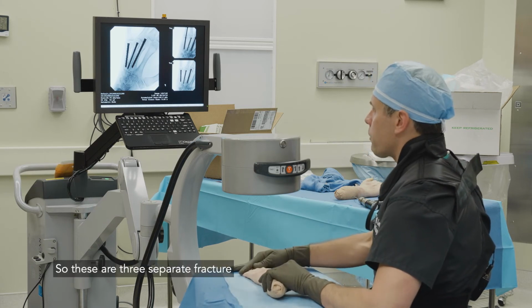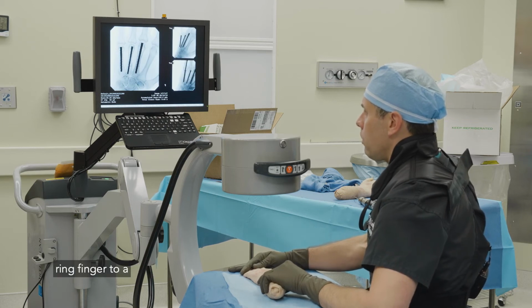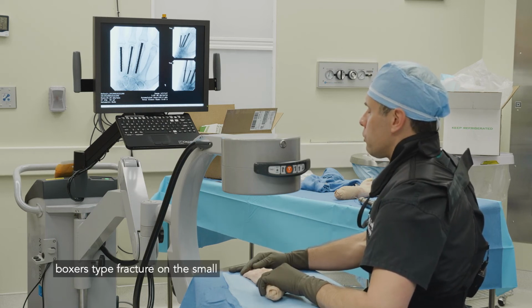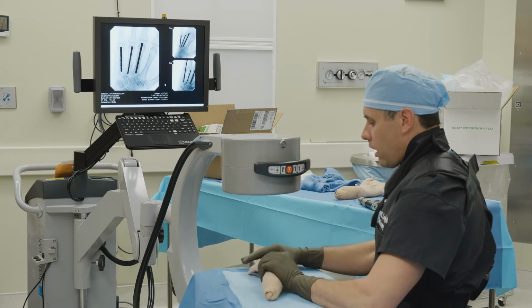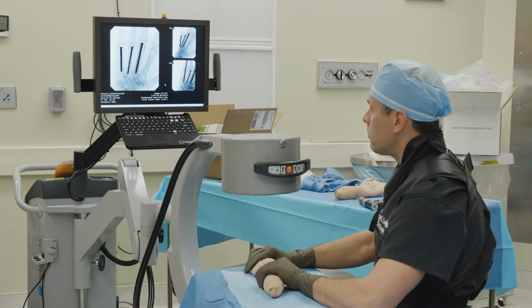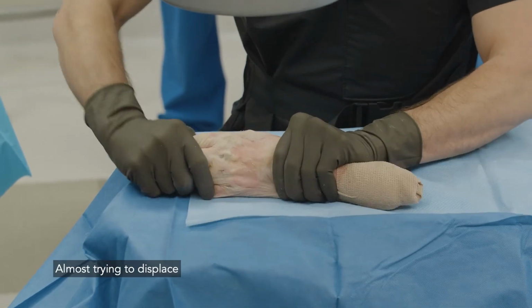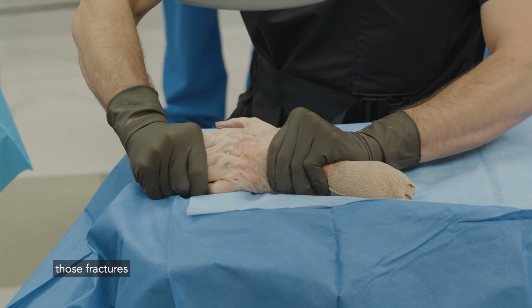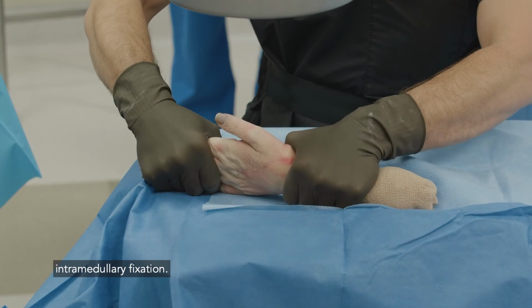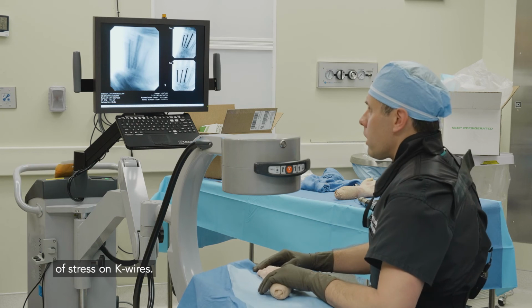So these are three separate fracture patterns going from very unstable on that ring finger to a comminuted neck fracture on the middle, and then a typical boxer's type fracture on the small finger. With all of these, I'm very confident in range of motion. I'll move these extensively, almost trying to displace those fractures, and you can see the rigid stability of that intramedullary fixation. There's no way I would try that type of stress on K-wires.